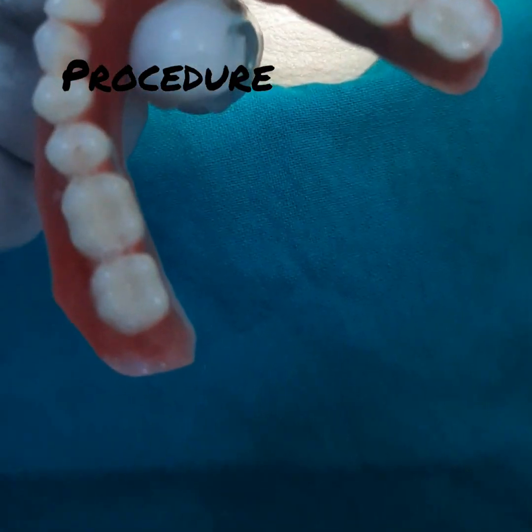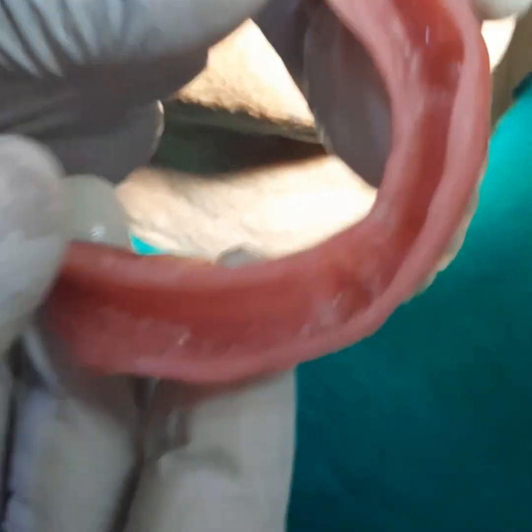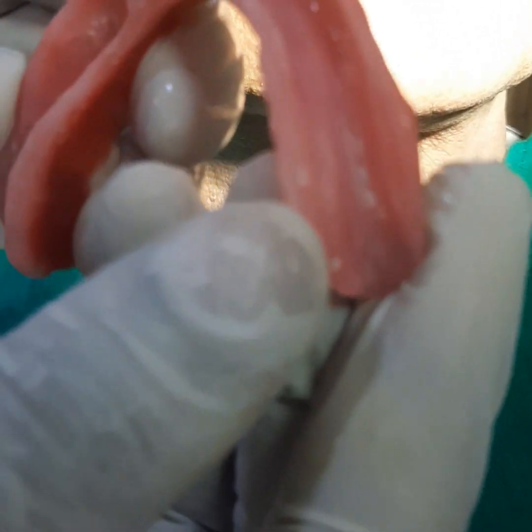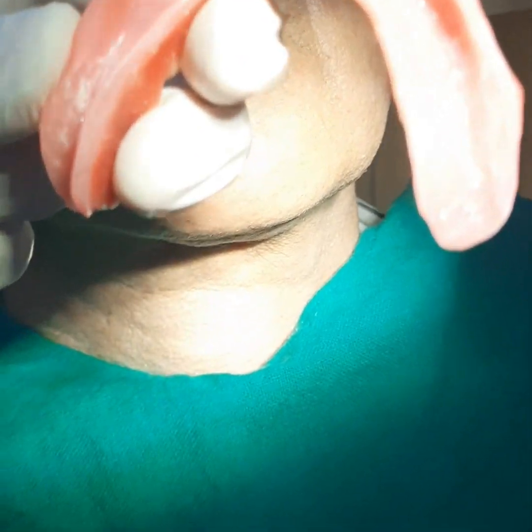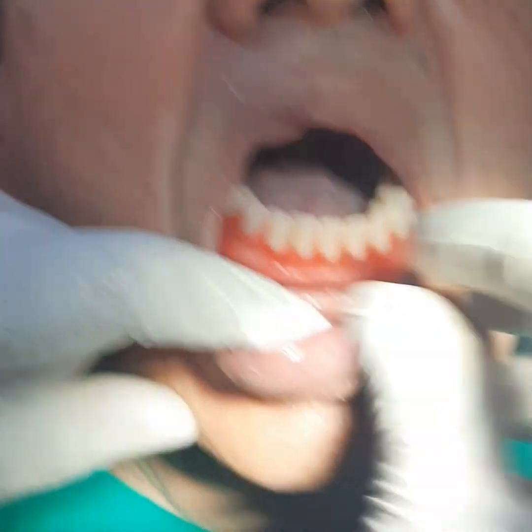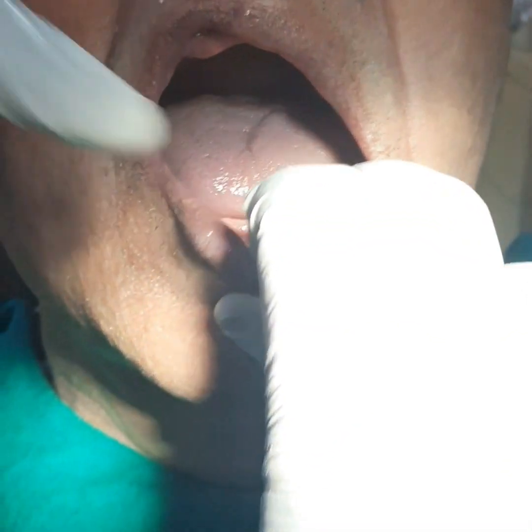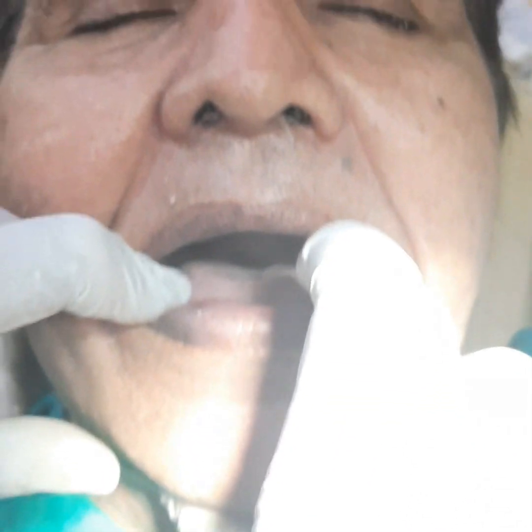When we start, we will be first placing the lower denture. You can see the lower denture — this is actually an implant lower denture case — and before placing it we will be examining it to see if there is any acrylic bleb or anything. Then we are going to place it into the patient's mouth and see the arch of the patient.